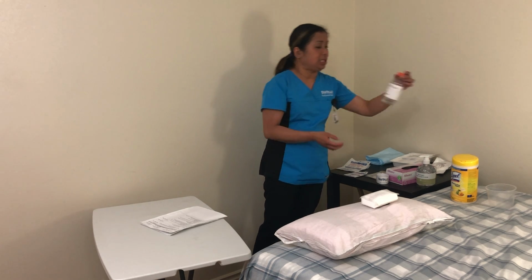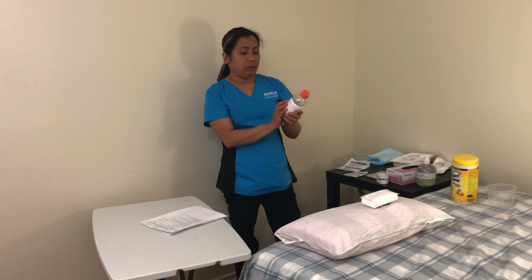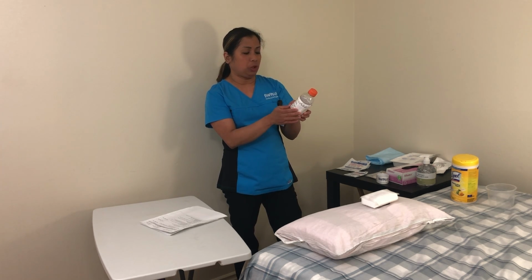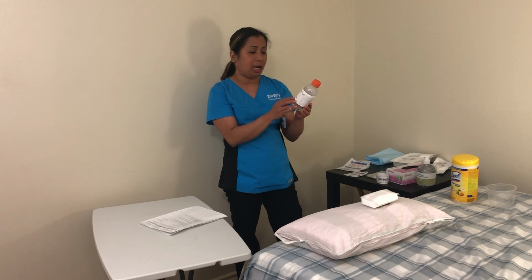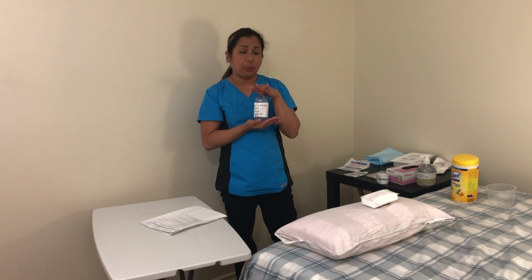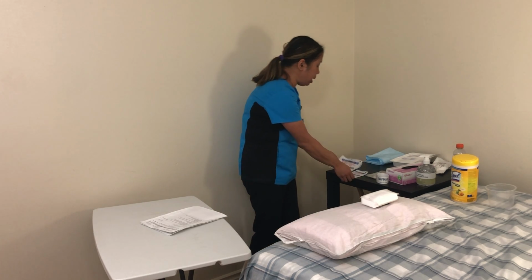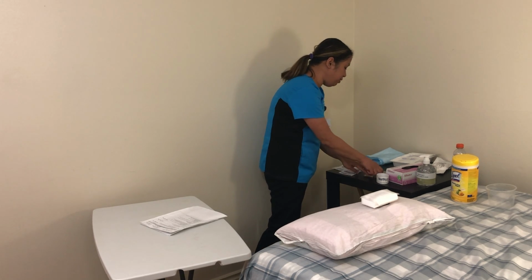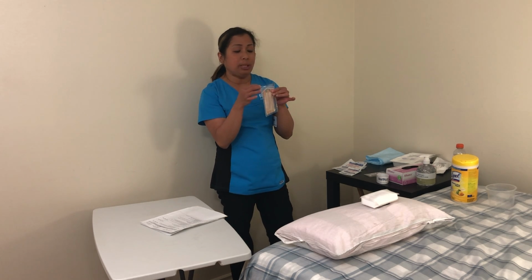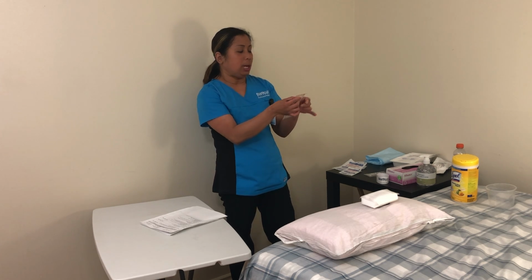This is my normal saline solution, assuming it is open already. It is 0.9% sodium chloride for one dressing. Expiration date July 2021. Date opened is October 14, 2020, yesterday at 1800 hours, so this is still good because it's not yet 24 hours. I have the 2x2 and 4x4 sterile gauze, assuming not yet open. And I have sterile strips, assuming not yet open, and the expiration is August 2024.